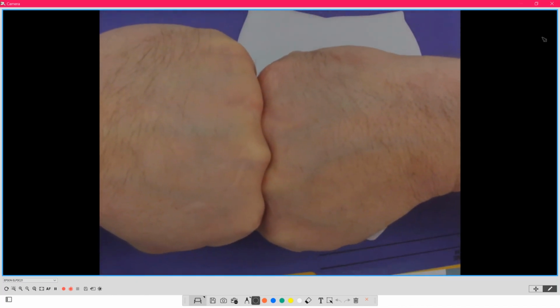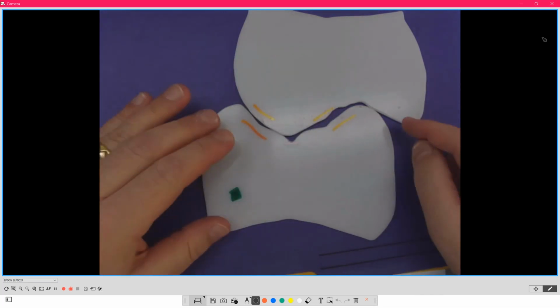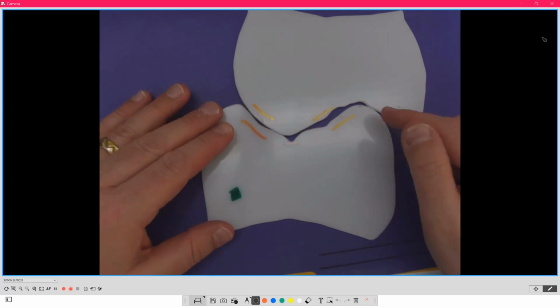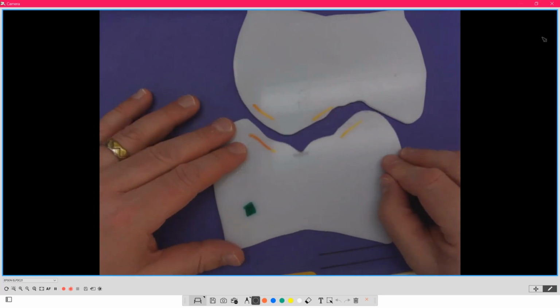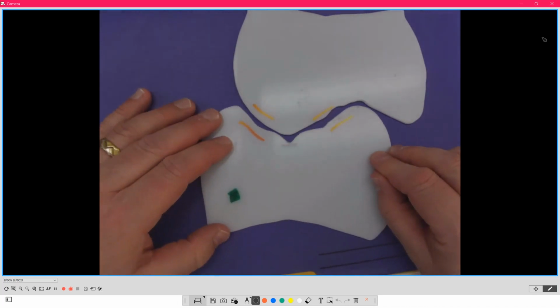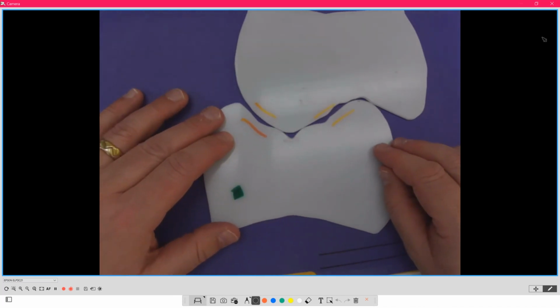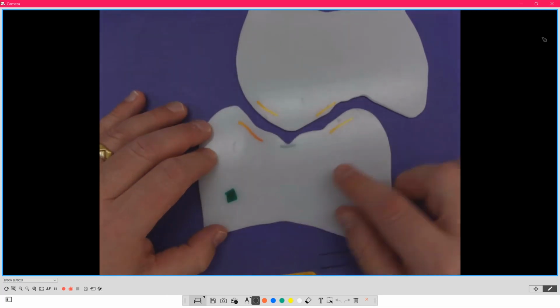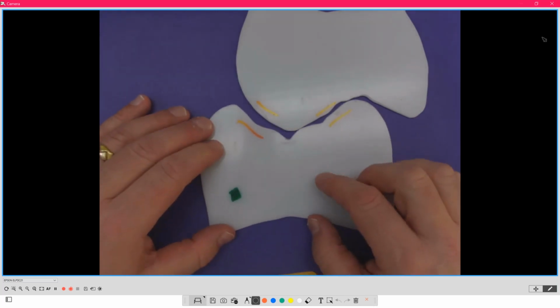Everything was kind of tight and squished together. And now on a setup, I don't have that. I have these little gaps and spaces in, which I will again show you soon. This is important because it allows freedom when the patient's going through their chew cycle. They're able to function within their chew cycle, land on a helicopter pad, and not have that contact, without hitting and sliding into position, causing the problems.